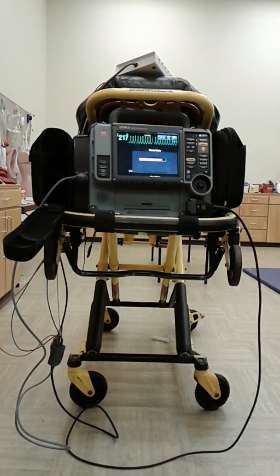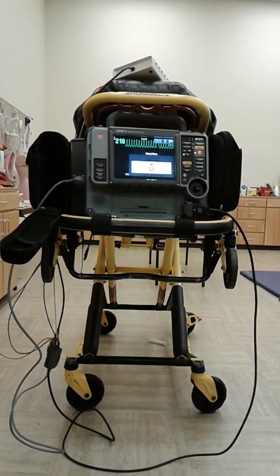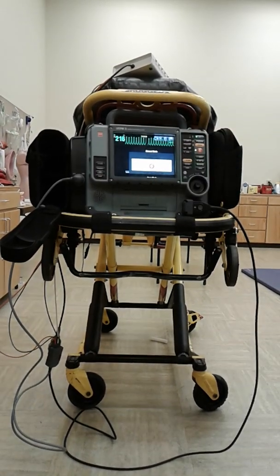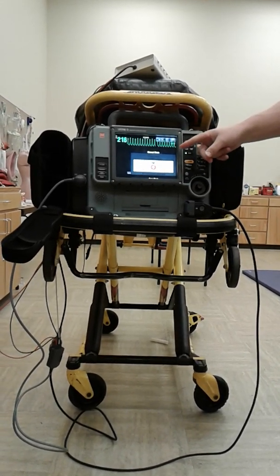And if y'all think about it, kind of hit the print button too. Yeah, that way it prints it out. Most of them should. As soon as you hit the cardiovert, it'll start printing. But right now would be a good time to hit the print button. Okay? And it starts showing you what you were in before you cardioverted the patient.